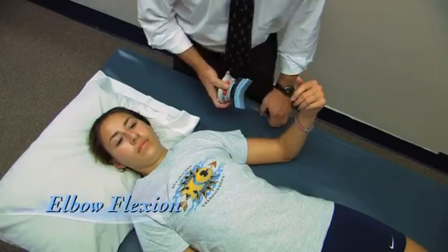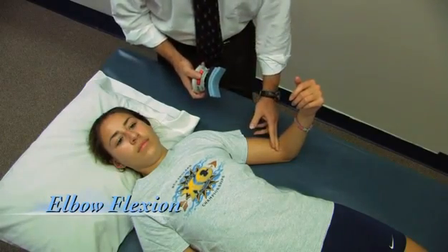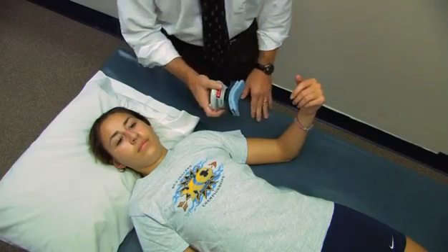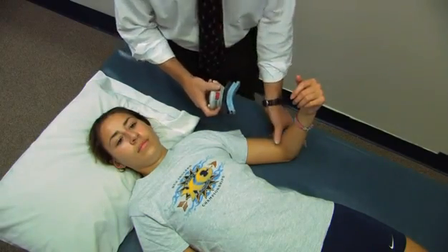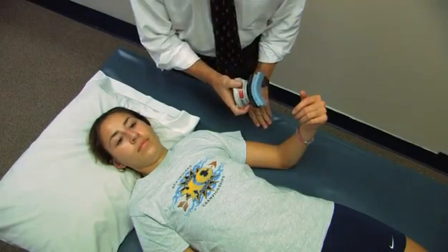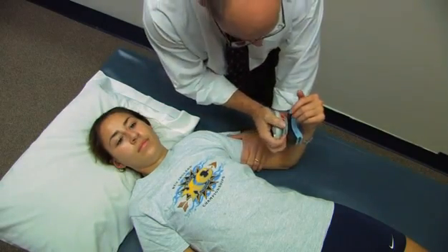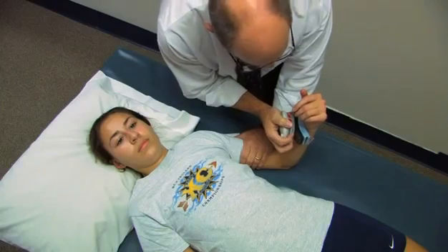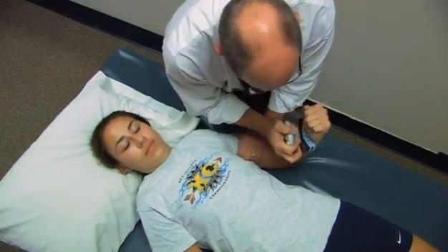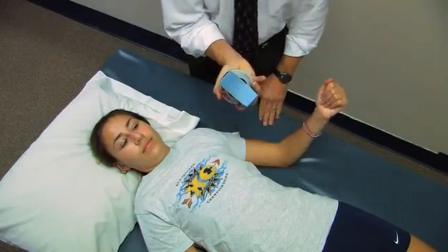Now we're going to measure elbow flexion. This is done with the elbow at 90 degrees. The dynamometer is placed just proximal to the styloids. When I say go, you take a second or two to your maximum effort, then continue until I say stop. Go ahead — harder, harder. And relax. 44 pounds.